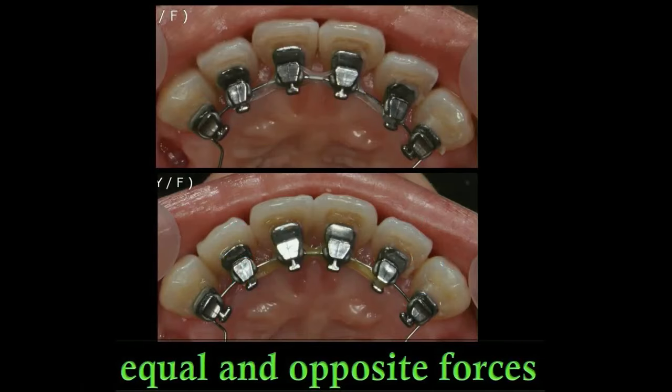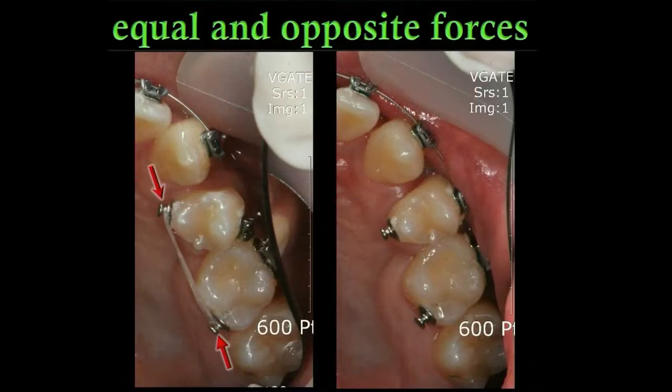Laterals are rotated, and we know that rotation control by lingual bracket is very difficult because bracket width is small. Rather than rotation control by tight ligature, simple elastic will produce equal and opposite force and easily correct the rotation. Both premolar and molar are rotated in correct direction by simple elastic on lingual side. If continuous labial arch wire was used, there should be many adverse side effects.